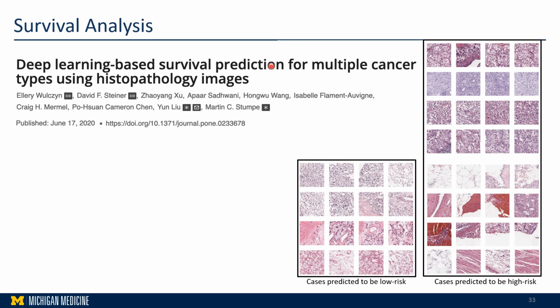In terms of survival analysis, this study identified the factors a machine learning model considered predictive of high-risk or low-risk patients regarding their survival. By taking a reverse approach, we can examine the features these models use to potentially uncover diagnostic indicators that pathologists may not have recognized. This insight could be valuable in identifying additional characteristics linked to patient survival outcome.